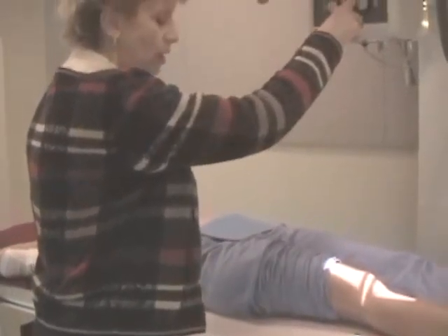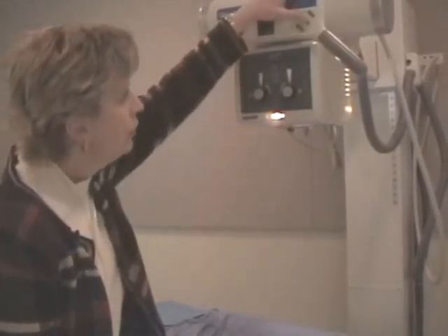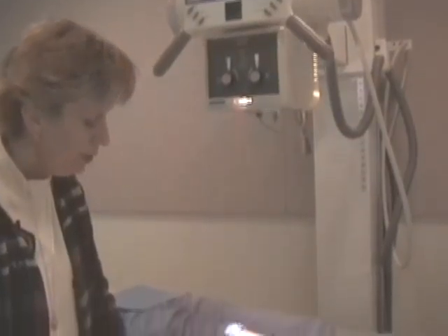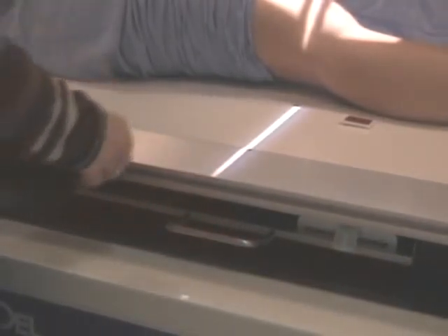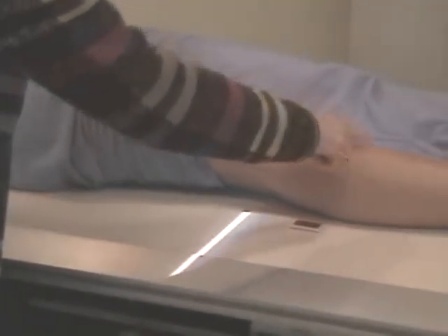I have 10 by 12 collimation, and again I mentioned we have the cassette. Once the tube and the film are lined up in a floating tabletop unit, you can push the cassette in and then just float the table to where you need it. The femur is straight, and I'm going to put this crosshair down the center of her leg.